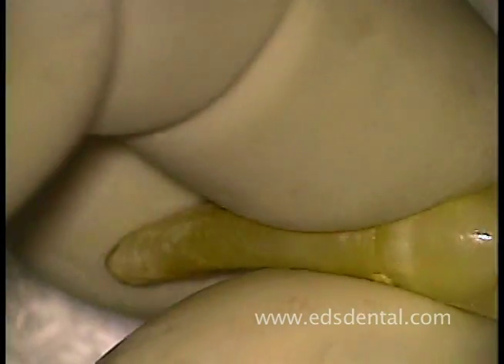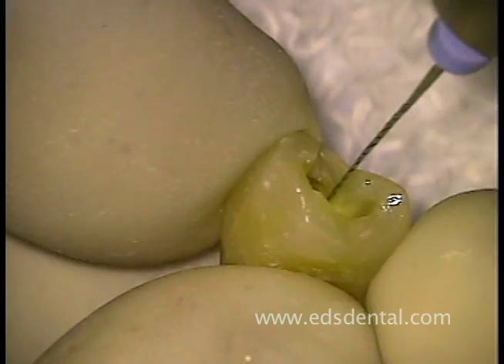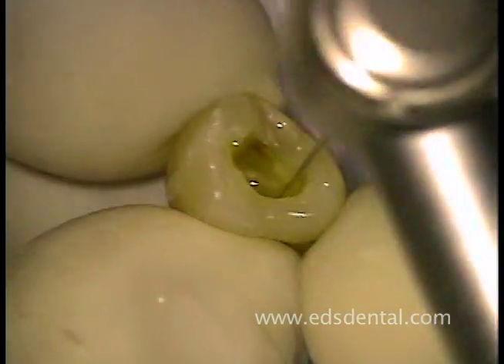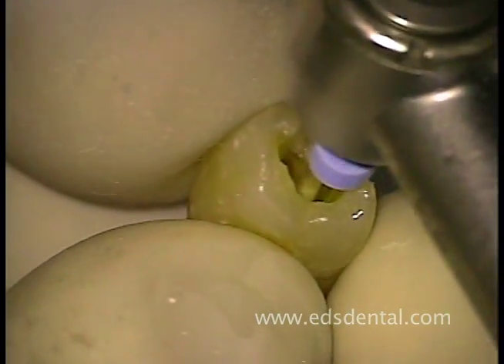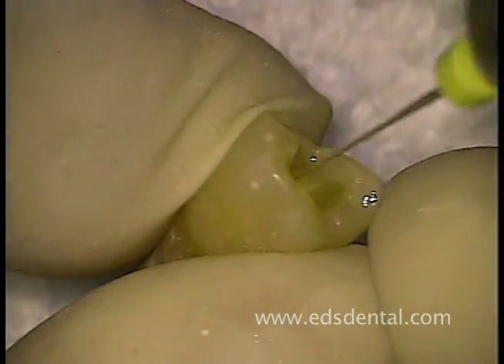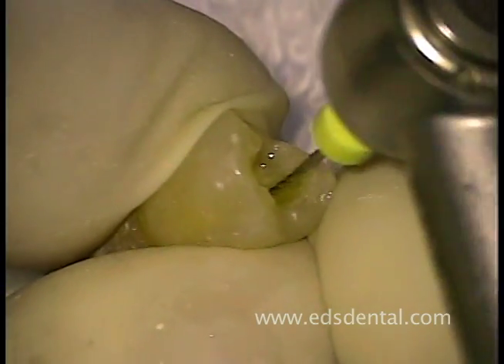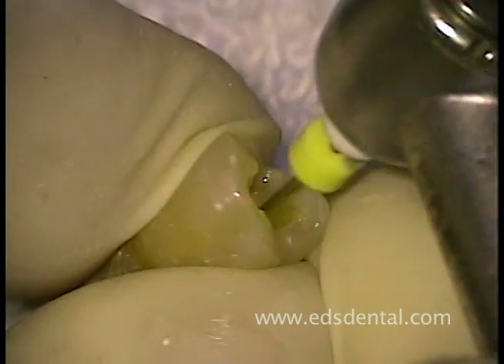Once patency is established, I routinely place the reamers into a reciprocating handpiece at a speed of approximately 3,000 to 4,000 oscillations per minute. In this case, the first reamer used in the reciprocating handpiece was a number 10. I followed up the number 10 reamer with the number 15 relieved reamer. Please note that it only takes a few strokes with each reamer before proceeding to the next.